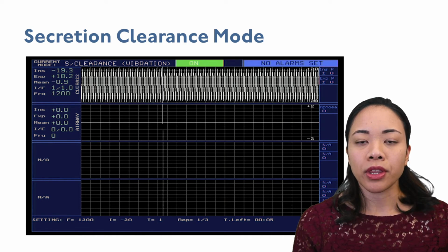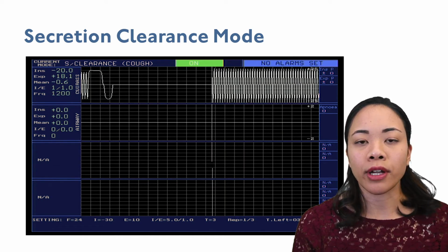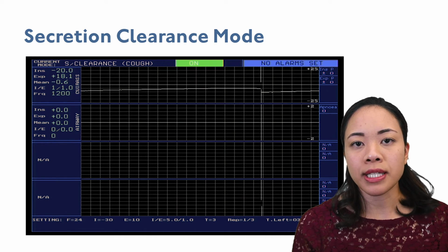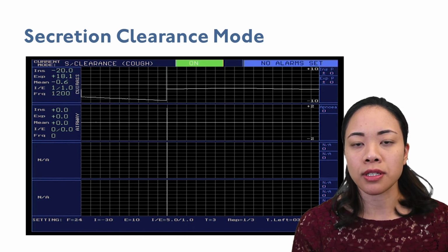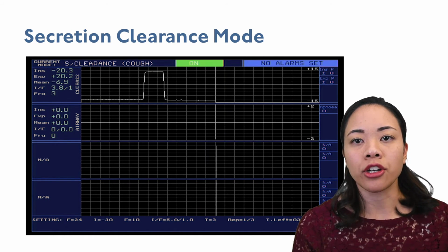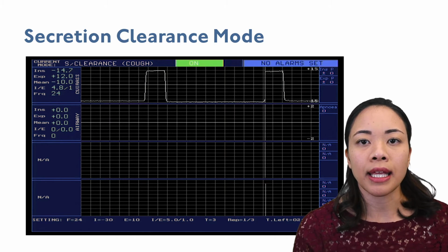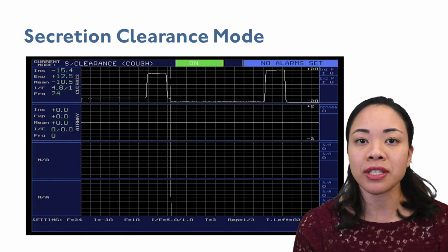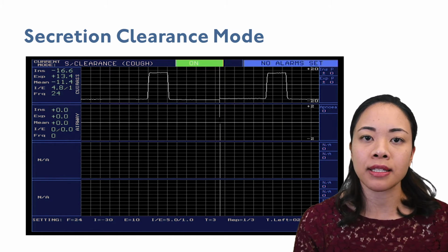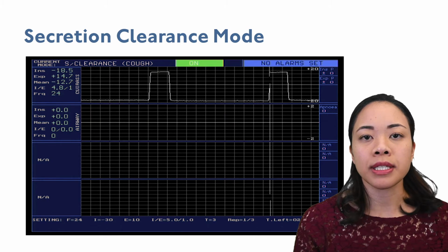For the cough phase, the RTX supports the components of an effective cough. Start at a rate of around 20 to 40 cycles per minute, more if the patient prefers or for better effect. 24 cycles per minute is generally recommended for alert patients because it allows good rate and predictability. As long as settings or alarms are not displayed on the right of the screen, the graph should display each cough in the same position in the sweep as the prior coughs. Patients can then be coached to huff or use whatever cough effort they have and coordinate with the positive phase for greatest effectiveness. Use an inverse ratio of about 4:1 up to 6:1.